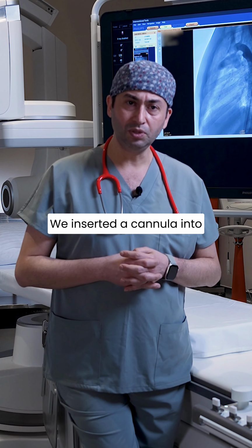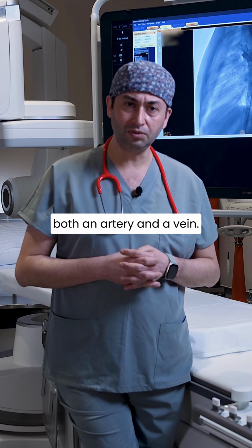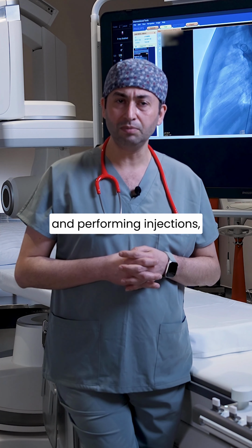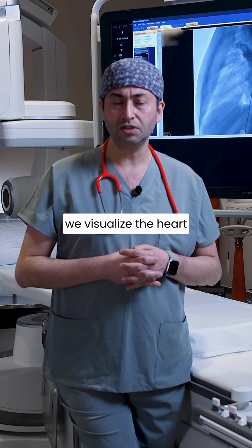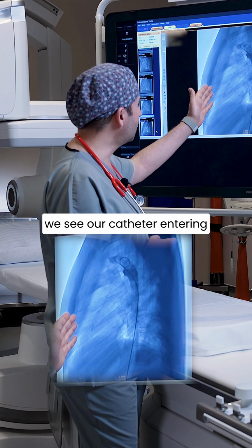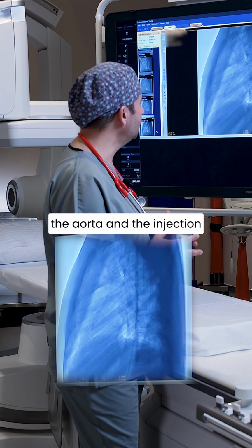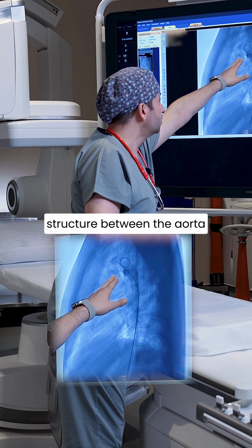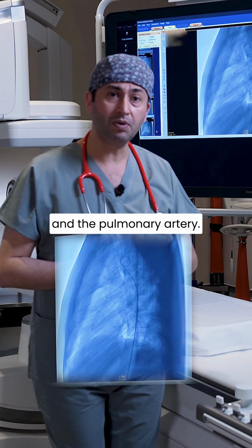After they were asleep, we inserted a cannula into both an artery and a vein. By passing tubes through these cannulas into the heart and performing injections, we visualize the heart and this abnormal vessel. In this first image, we see our catheter entering the aorta and the injection being performed. As we can see here, there's a thin bridge-like structure between the aorta and the pulmonary artery.